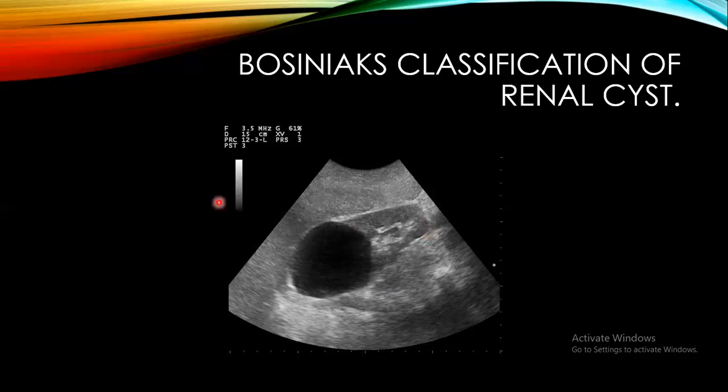First, we do aspiration percutaneously under ultrasound guidance by spinal needle. We pass through the skin under ultrasound guidance with the spinal needle into the cyst. We reach it with the spinal needle, we see it with the ultrasound, and we withdraw the contents. We do aspiration of the content of the cyst, and then we inject about 30% of the aspirated fluid.